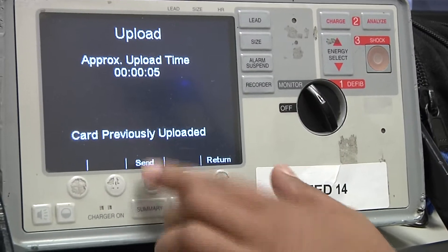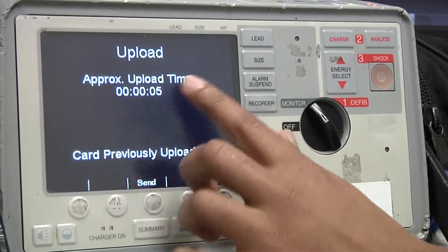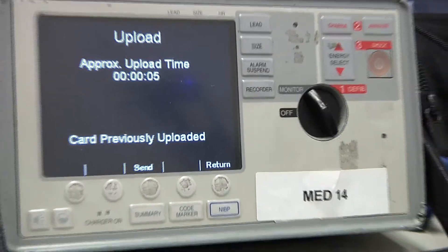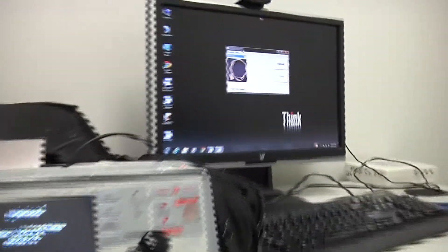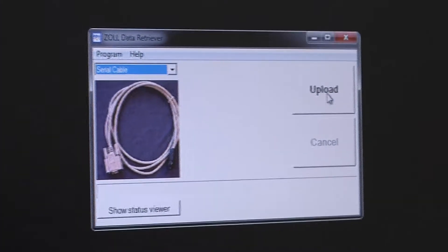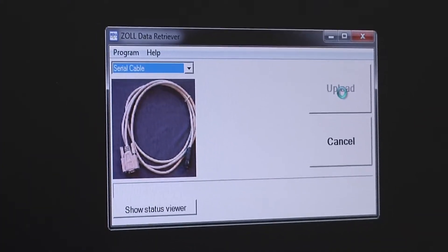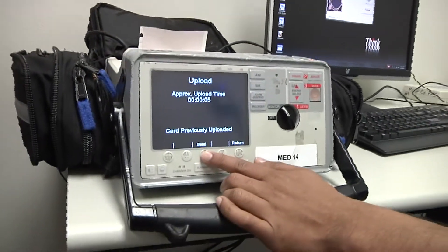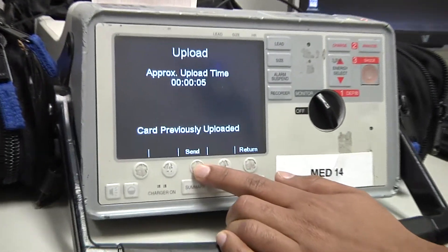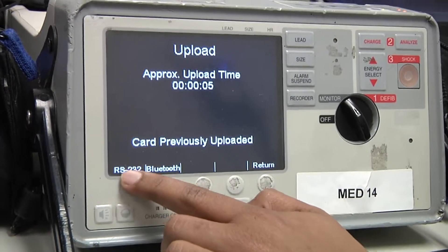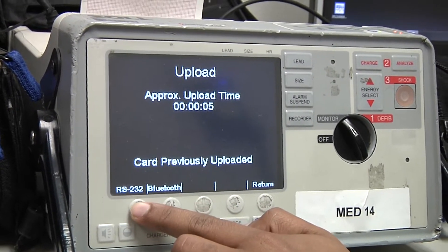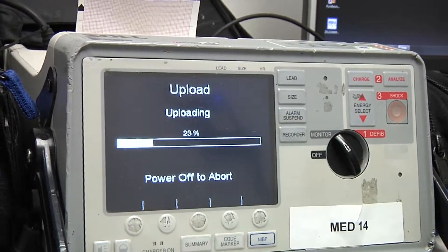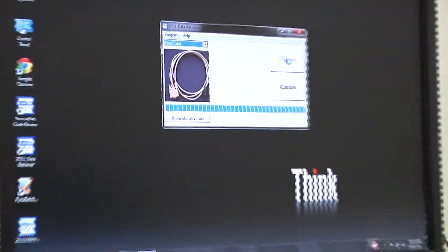I'm going to select upload call, and this display pops up showing upload and a message that says card previously uploaded. I'll come back over to my Zoll data retriever console and simply click upload. A thinking icon pops up, then I come over and press send. I select the RS-232 option because that's how we're transmitting it, and then it pops up the uploading display.